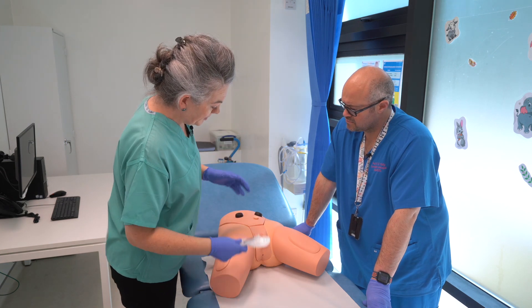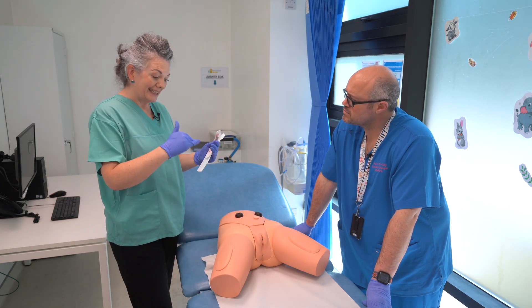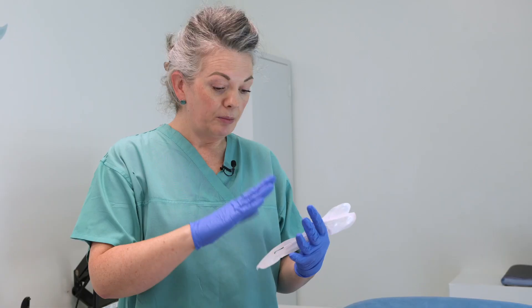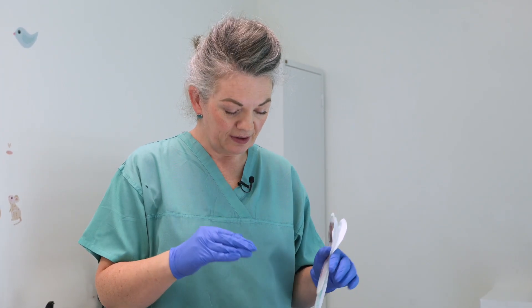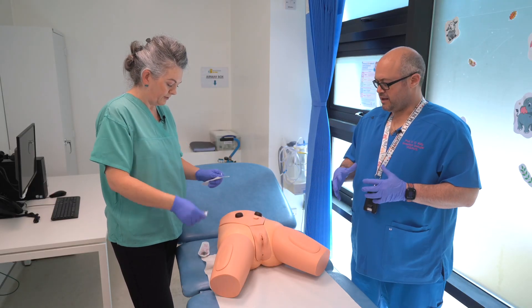For the female, similar to the male, just clean the area — a wipe, water and gauze, whatever you have. There is no need for any cleaning solutions. I'll go with the 20 centimeter catheter first.